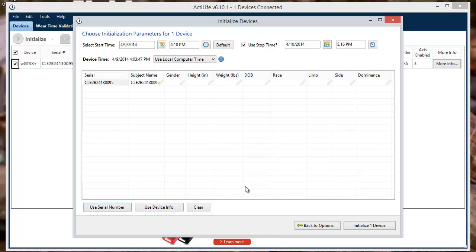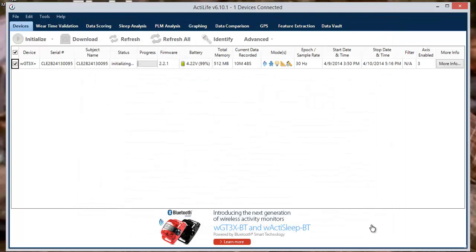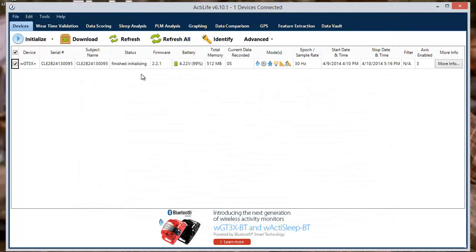Once the subject information is set, the device can then be initialized. Simply click Initialize Device on the bottom right corner. This will close the floating window and the progress bar will begin. Once completed, the status will change to Finished Initializing.